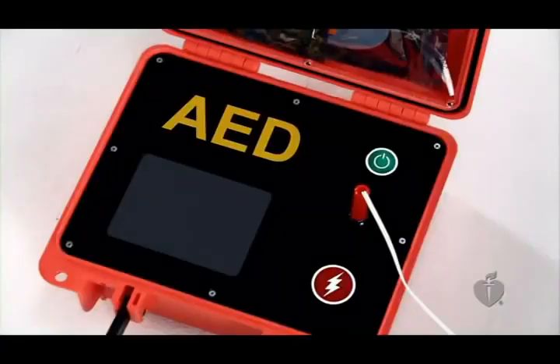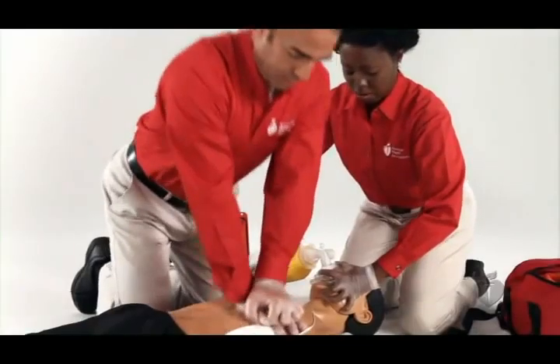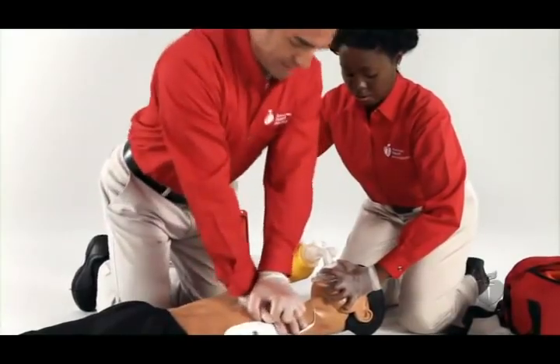No shock needed. When the AED indicates no shock advised, you do not check the pulse first, you immediately start chest compressions again. There are also some special situations you'll need to consider when using an AED.